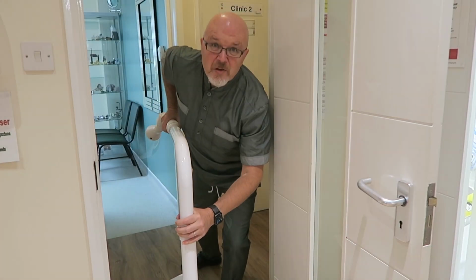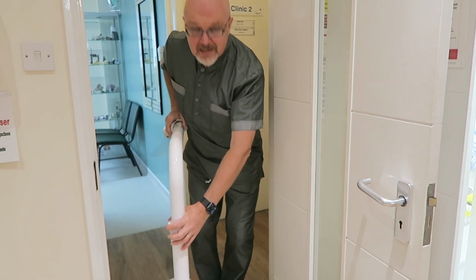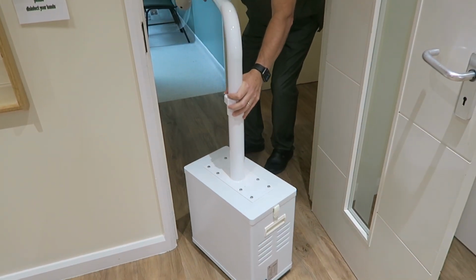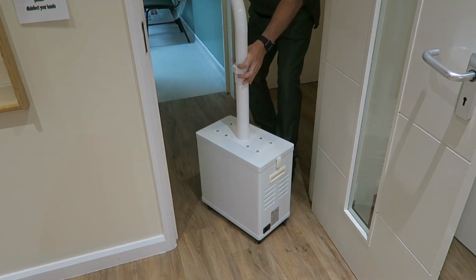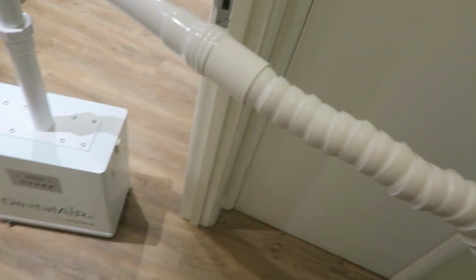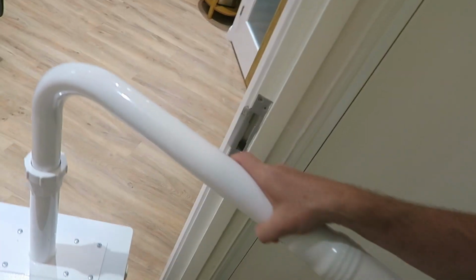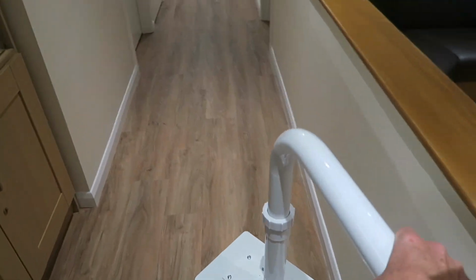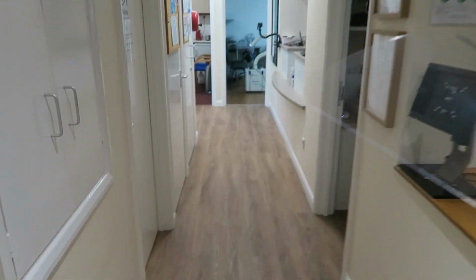Right, okay guys, so now it's the turn of the DentalAir. I've got the unit down here. Obviously it is completely on wheels, so we can roll this around. I've got the Rigiflex arm there, which I can just use as a sort of a handle to push, and we can wheel that down the corridor.